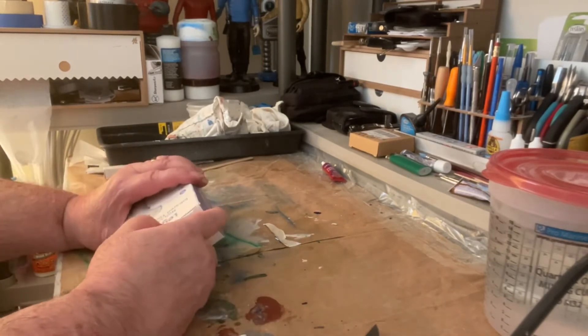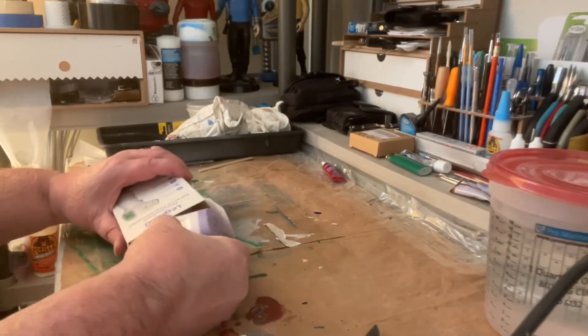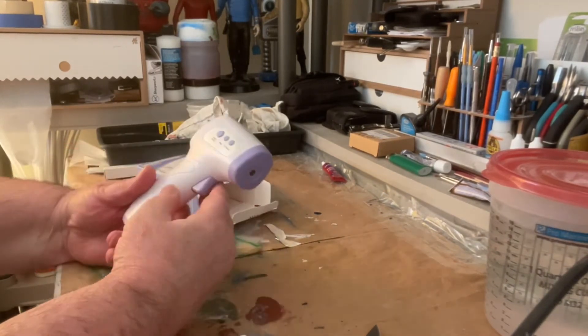I may have to cut away for a little while if it doesn't have batteries. It's by Legend, and it's color pink.